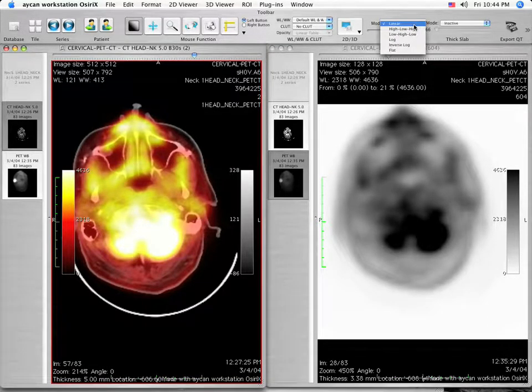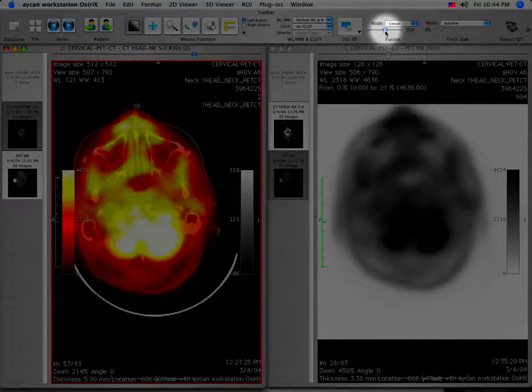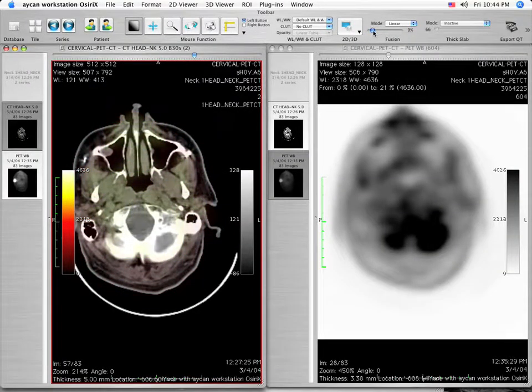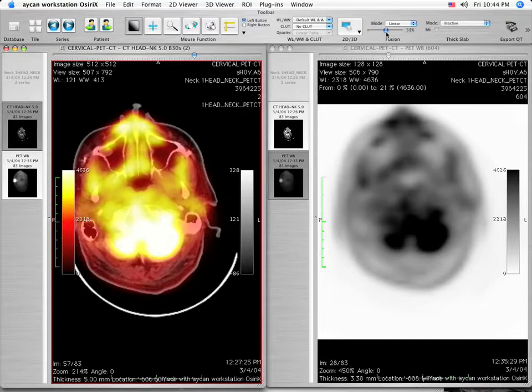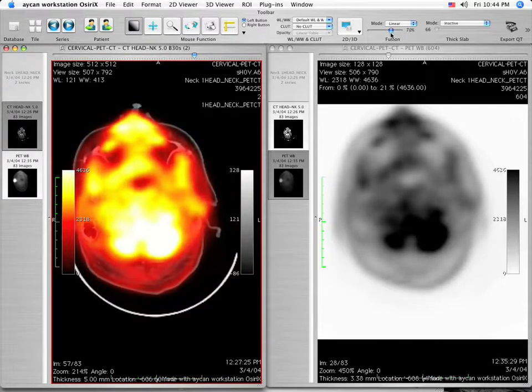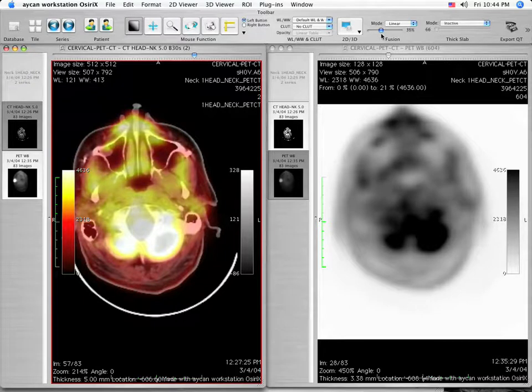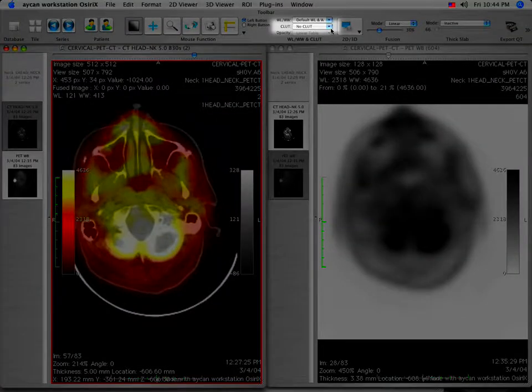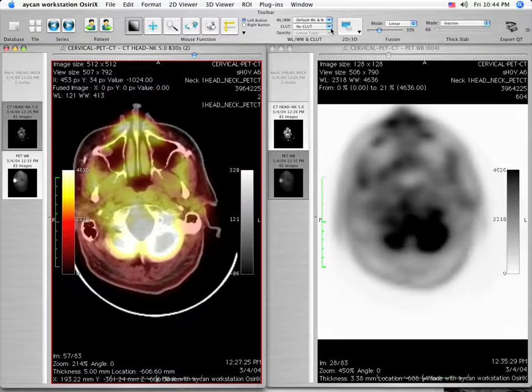While in the linear mode of the Fusion Tool, move the slider bar using the left mouse button from 0 to 100%. The percentage value determines the degree that the PET series is fused onto the CT series. Various color lookup tables are available to the user from the window level and lookup table tool.